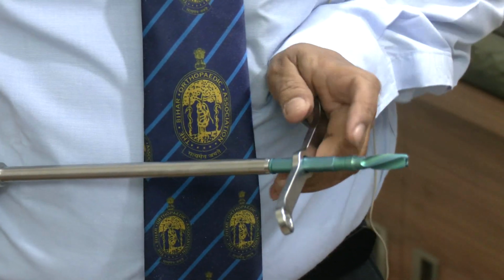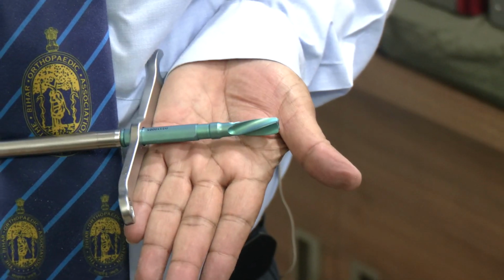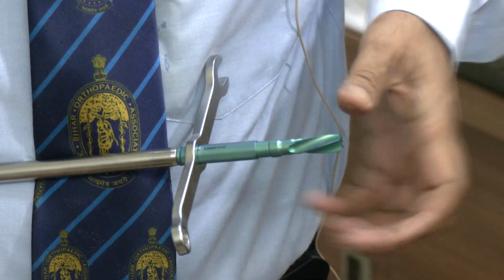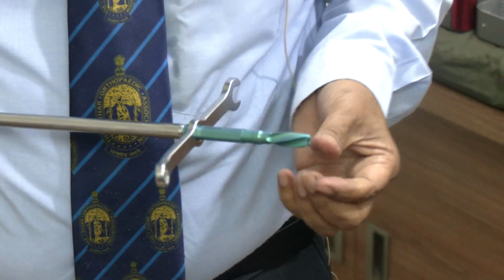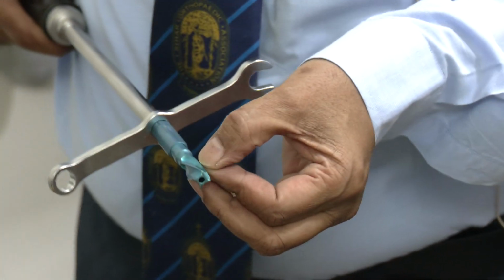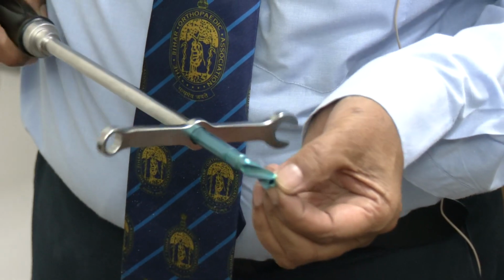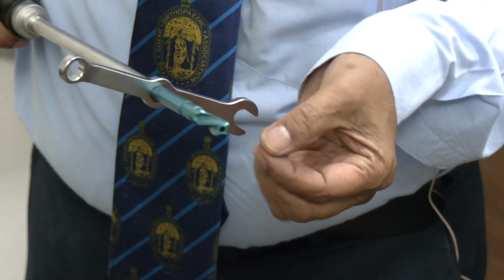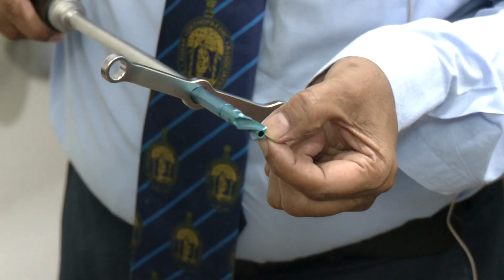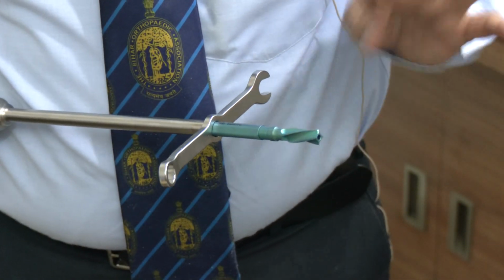you can see that this has opened up. About 5 millimeter it has opened up. Can you see? This much. Now it is free to move. While you are inserting, it rotates and goes inside. Because this has a spiral blade, it keeps on rotating and going inside. It won't remove the bone from everywhere. Once a slot is done, in the same slot it keeps on rotating and going inside. So that is the helical blade part.